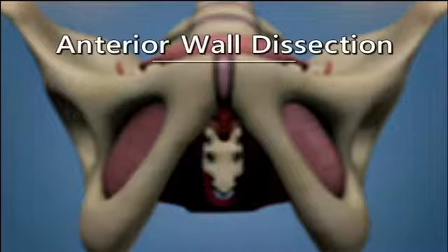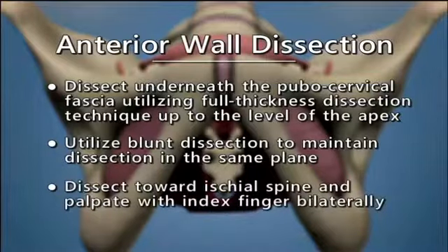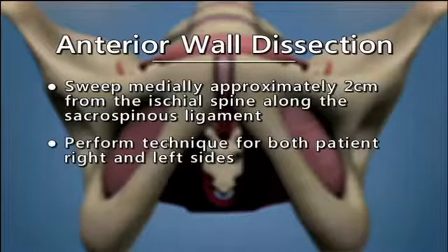Anterior wall dissection. Dissect underneath the pubocervical fascia, utilizing a full thickness dissection technique up to the level of the apex. Utilize blunt dissection to maintain dissection in the same plane. Dissect toward the ischial spine and palpate with your index finger bilaterally. Sweep medially approximately 2 centimeters from the ischial spine along the sacrospinous ligament. Perform this technique for both patient right and left sides.